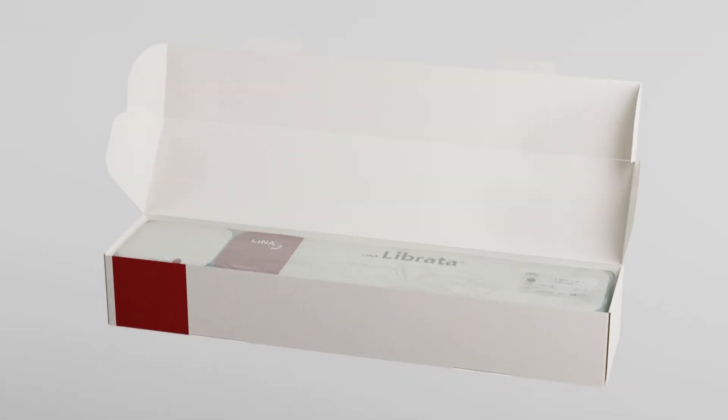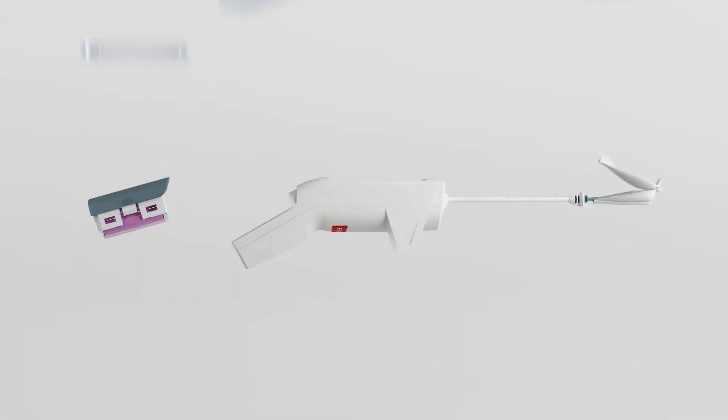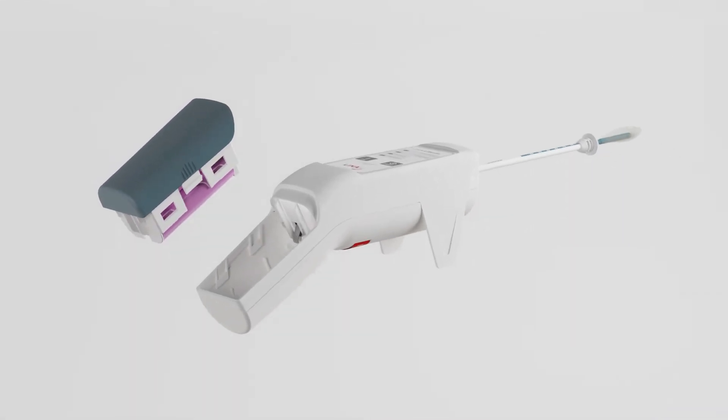With Lina Librata there is no complicated setup. Each single-use device comes pre-packaged with handpiece and battery, ready for use. No cables, no generators, no capital investment.